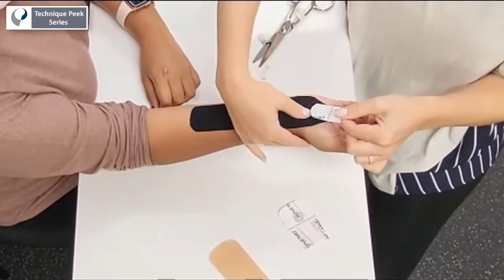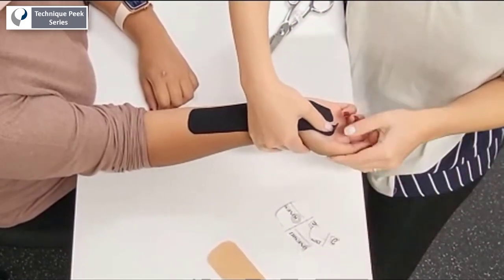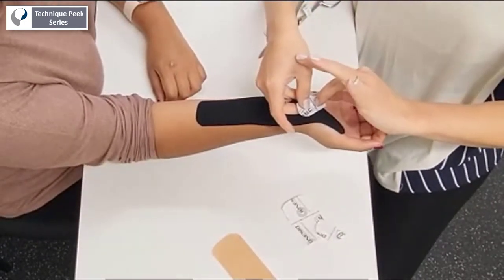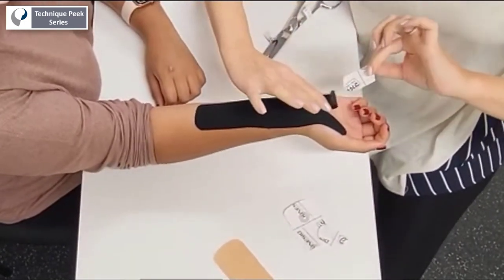Next, apply each tail along the thenar and then hypothenar eminence, being sure to allow the ends to recoil so that they can be applied with no tension.